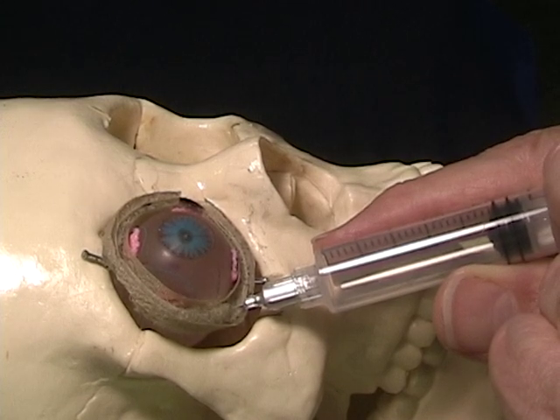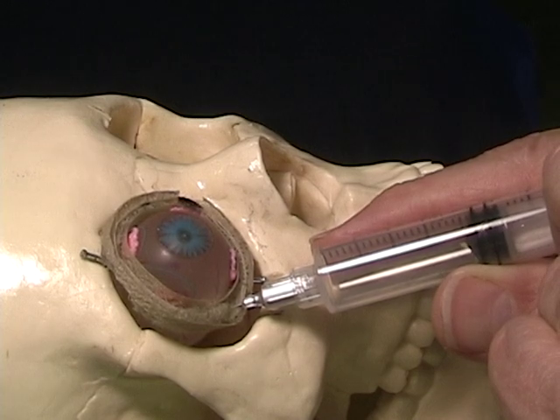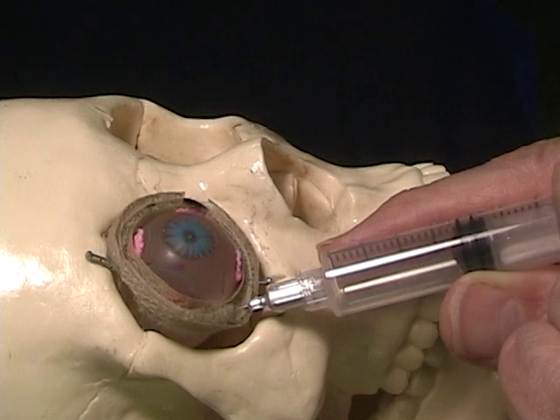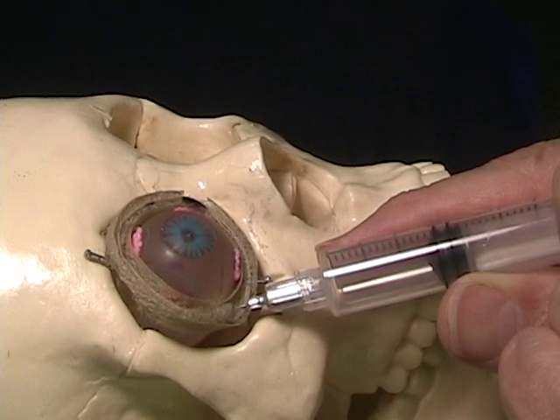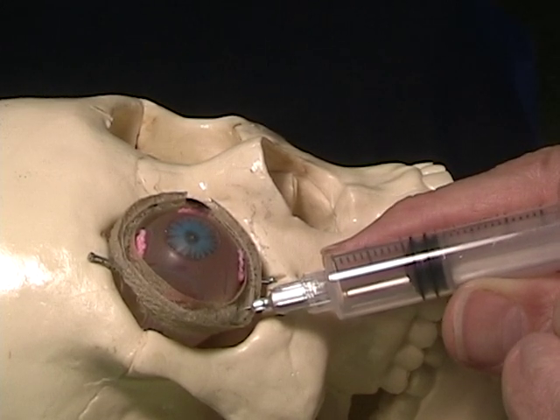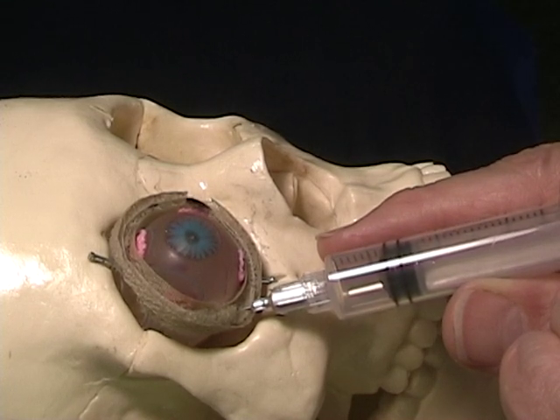In our patients at this point, we'd probably start to see the eye proptose as the anesthetic is injected into the intraorbital area. We may also see anesthetic come out peripherally — one area may be the superior nasal area, another the inferior nasal area, and we may also see it in the inferior temporal area.